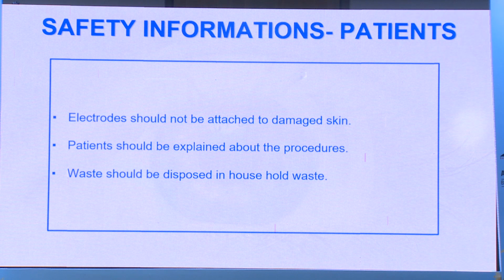For the patients, electrodes should never be used on damaged skin. The patient should be thoroughly explained about the procedure, and all the doubts have to be cleared, and the waste should be disposed of in the household waste.